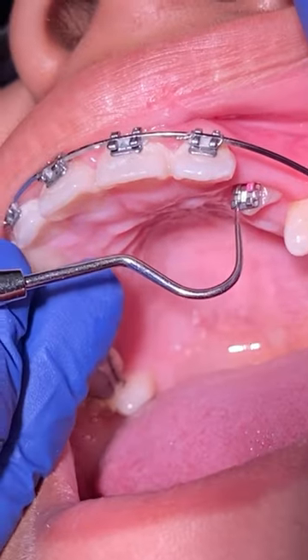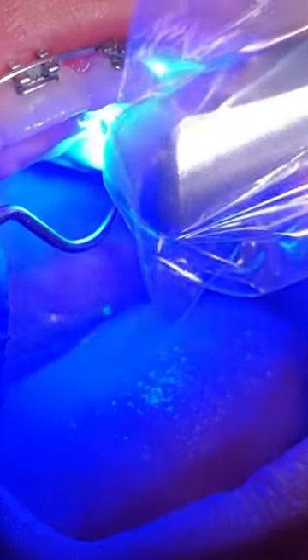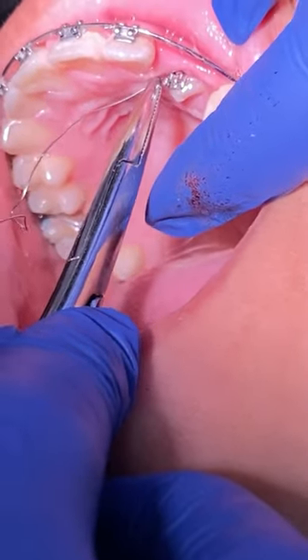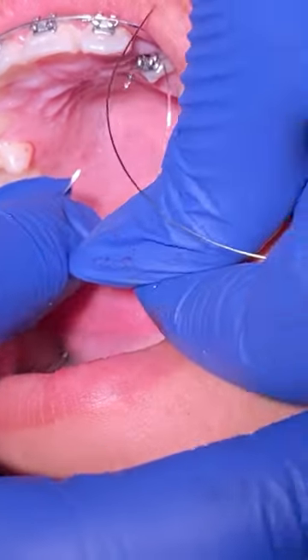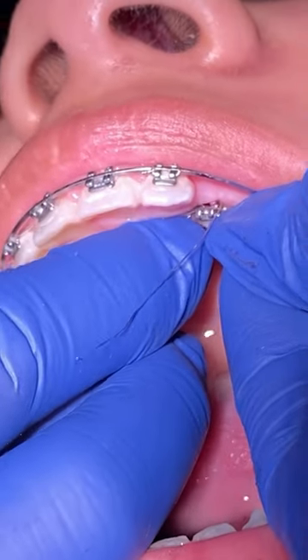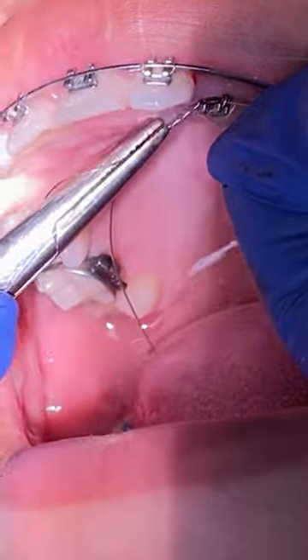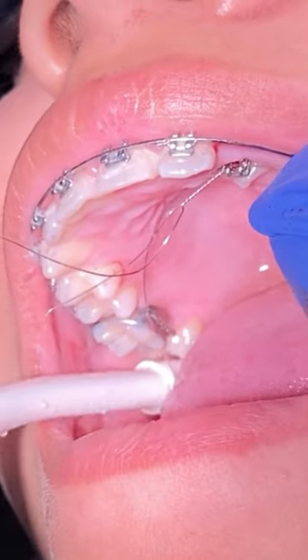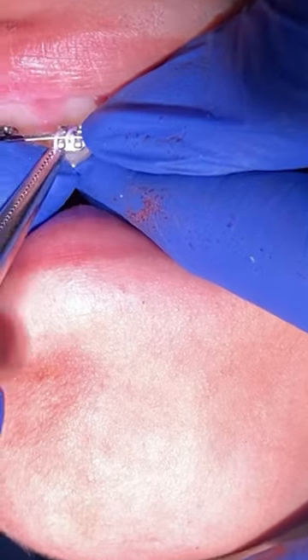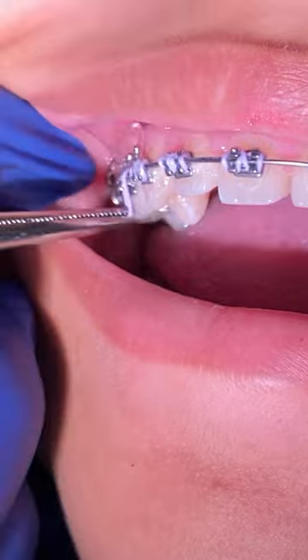We're going to start pulling the tooth forward using a piggyback method. We're going to place our original wire, then get another wire and engage it to the tooth that's trying to erupt a little bit more. Then we're going to engage with ligature ties and bring the other wire in the back forward and engage with the original wire — it's an activation pull method to bring the tooth a little bit more forward.